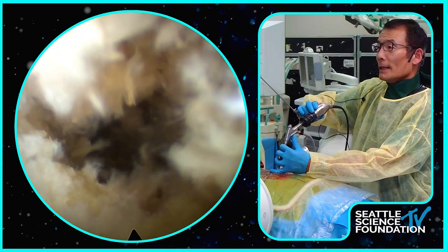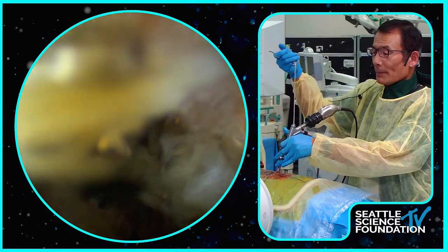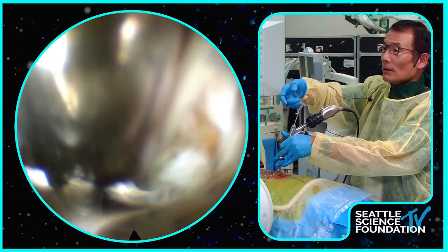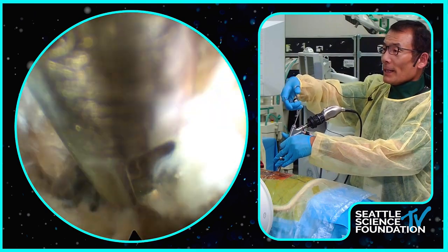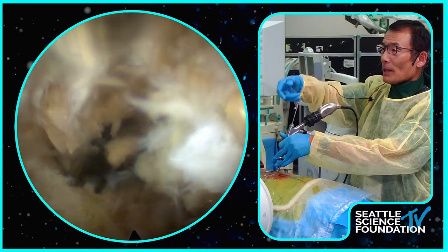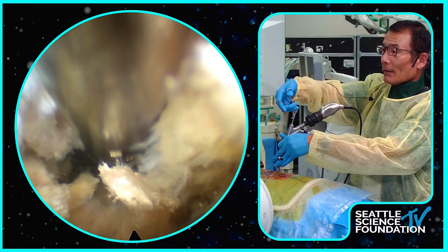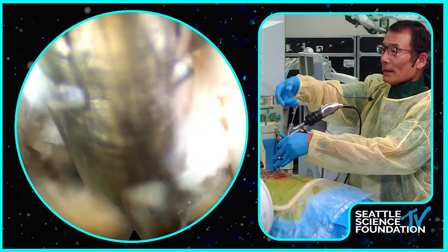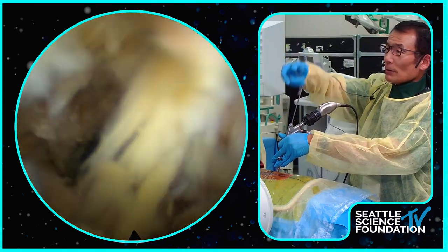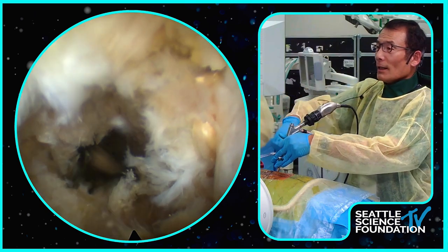You have enough room to do your discectomy. Of course, how big a space you create, the safety zone you create, depends on how large your footprint would be. I usually use an expandable cage. In the majority of my PLIF fusion, endoscopic fusion is for L5-S1. So you have a decent amount of room. For the upper levels, I prefer lateral.